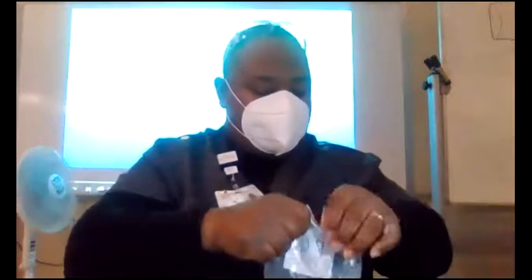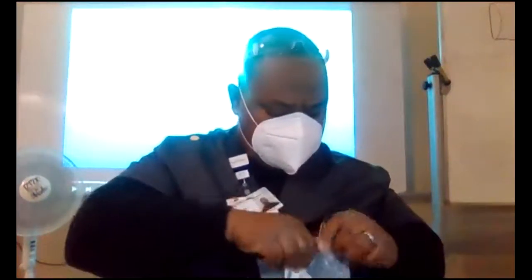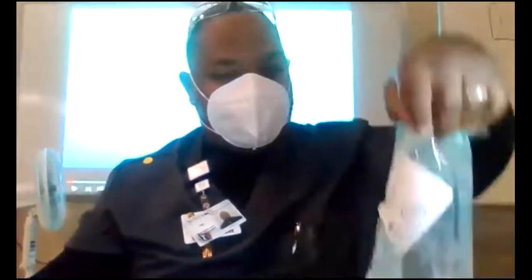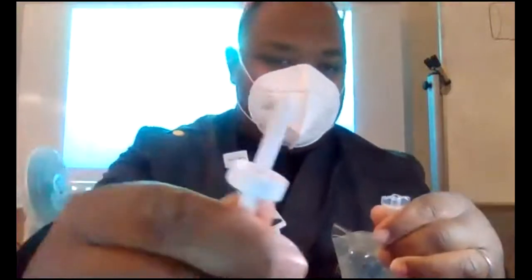One at a time, I would just open it up. Pull it out of the bag. Now, usually I take this sticker that's on here and slap it on my bag, just so everybody knows, this is not for IV. This is for inhalation. I will take this off like that. Take my needle part here. Stick it in there like that.